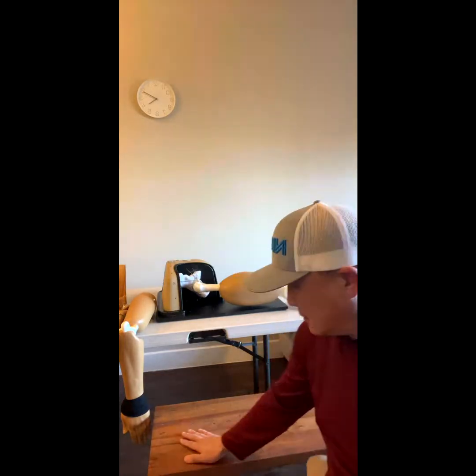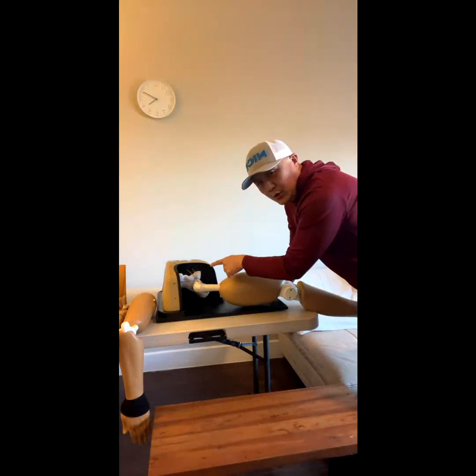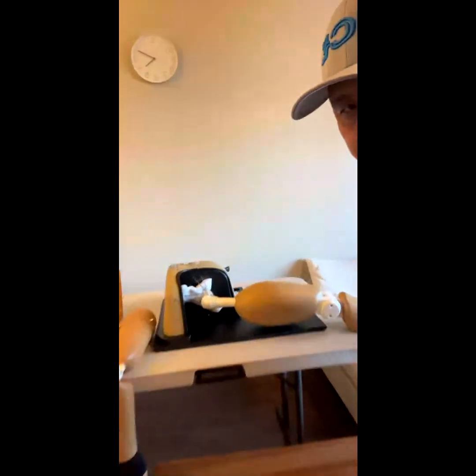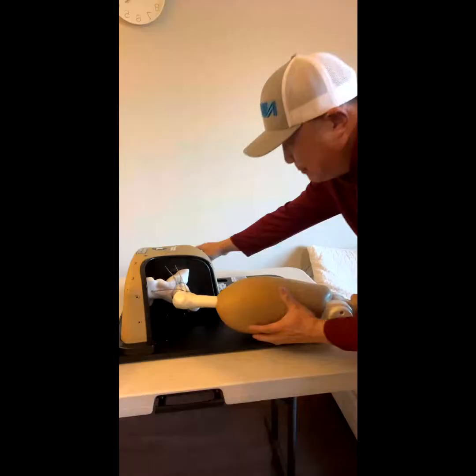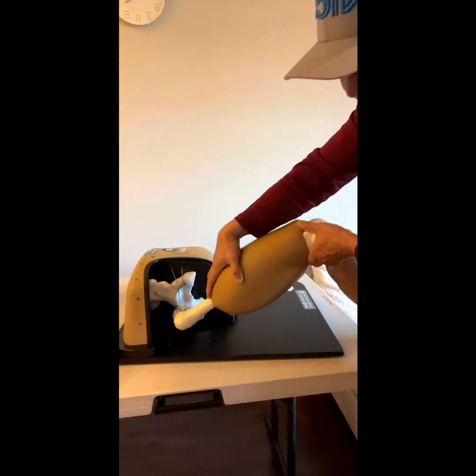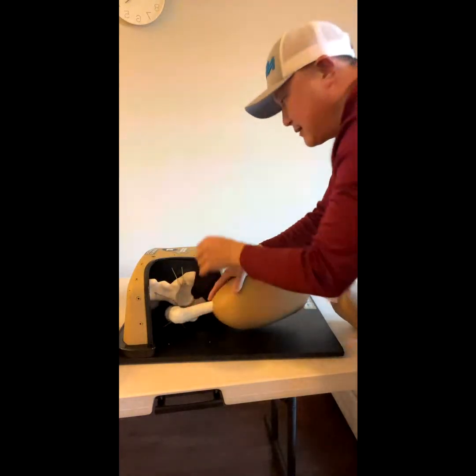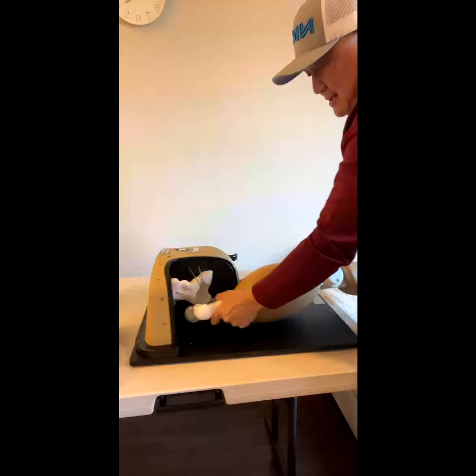This is the left hip model. It's in the joint right now. Dislocation happens and it goes to the back like that. Now the tension is set and you dislocate it.